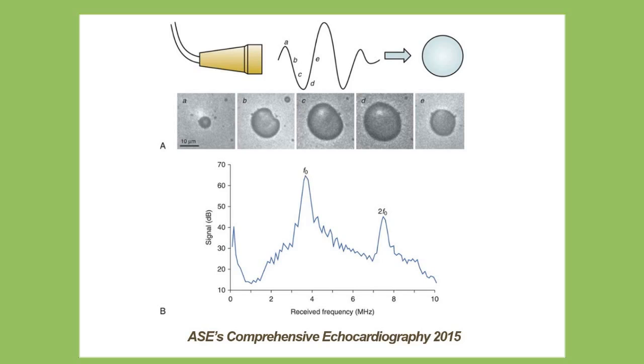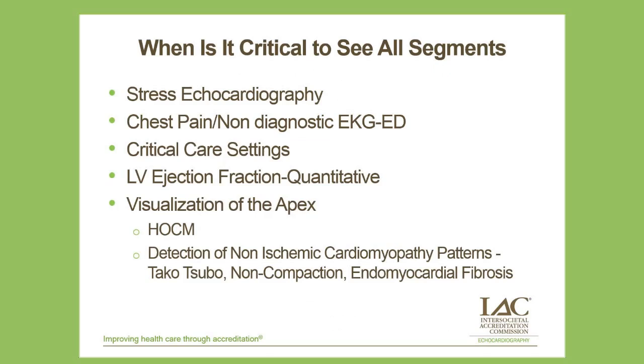The low MI imaging techniques take advantage of the fact that the microbubbles, even at 0.3 or 0.25 mechanical index, have this second harmonic response. And so a transducer can be set up to receive that signal, and although it's a lower signal than the fundamental frequency, it elicits primarily this activity from the microbubbles and very little from the tissue or any artifacts like side lobes that tend to cause a lot of interference with fundamental imaging, and allows us to see good ultrasound contrast in the left ventricle and not any of the artifacts that typically accompany fundamental imaging.